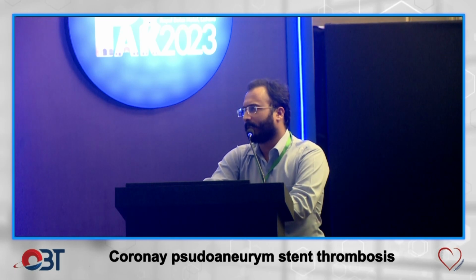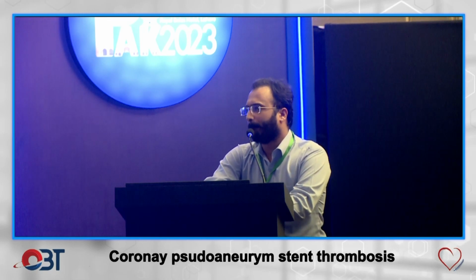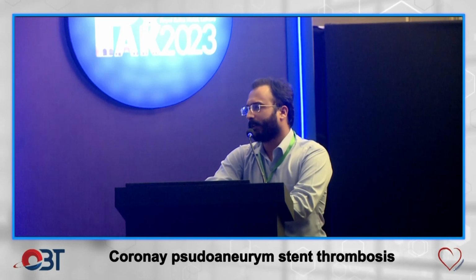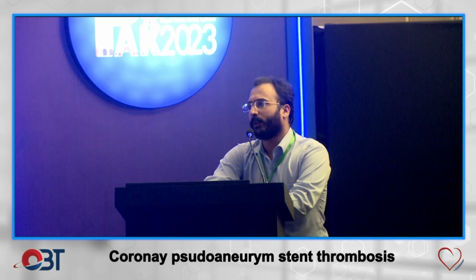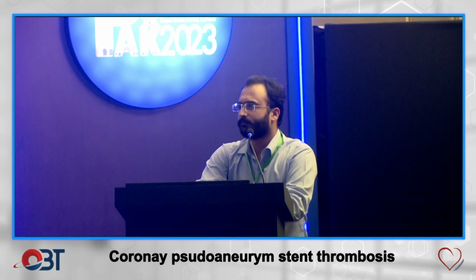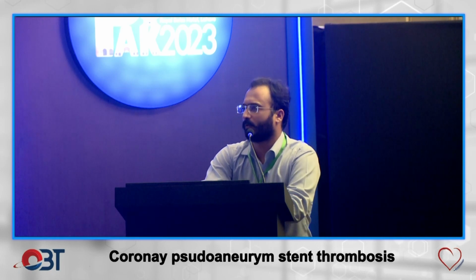So we were suspecting that 38 millimeter would miss the lesion. So we put 2 stents and overlapped them. This was 2.75 by 28 millimeter, the distal stent, and 3 by 24 millimeter is the proximal one, with an overlap of almost 3 to 4 millimeter.